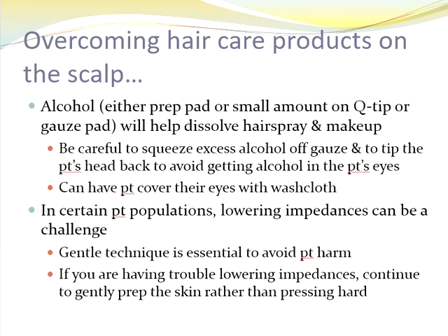So I used to use rubbing alcohol pretty much standard for every application. But I started to get away from that because you would have people that shave their head right before coming or coming with a sunburn. And so I started to just use rubbing alcohol if I felt it was necessary for overcoming hair care products and that type of thing. You want to make sure that you're gentle, especially when you're trying to get good signals. You don't want to cause any harm to the patient.